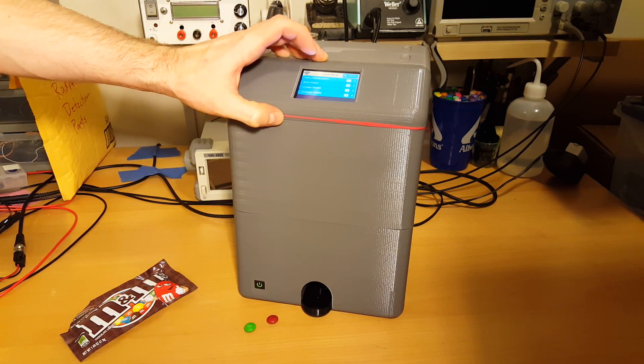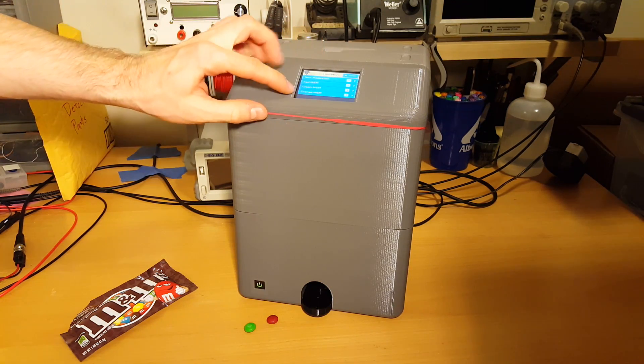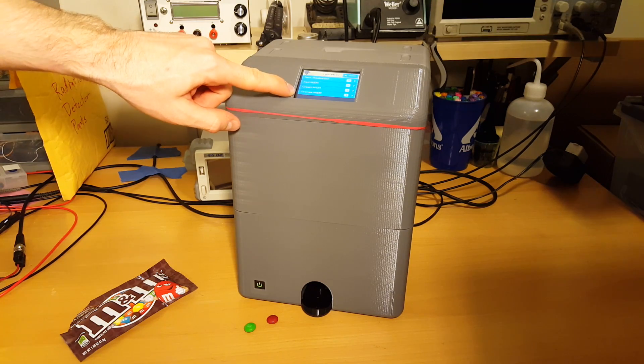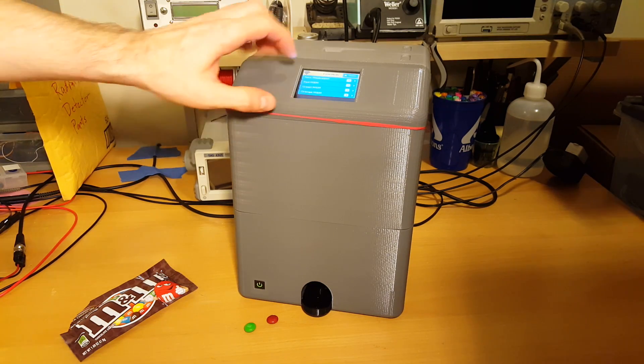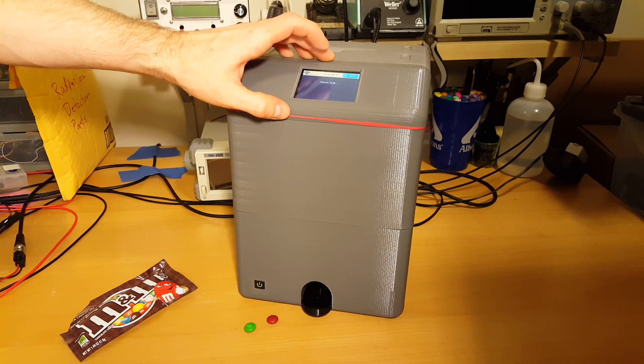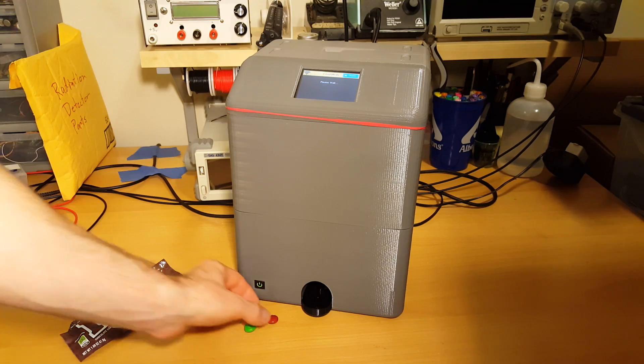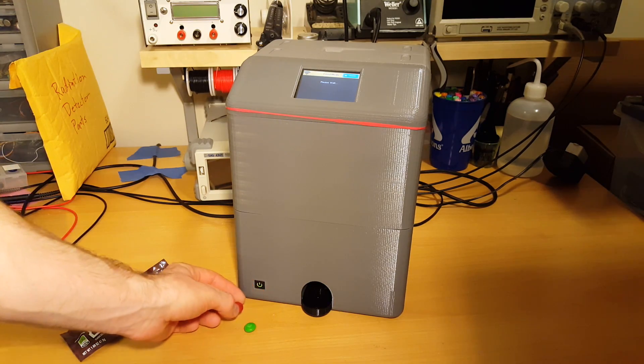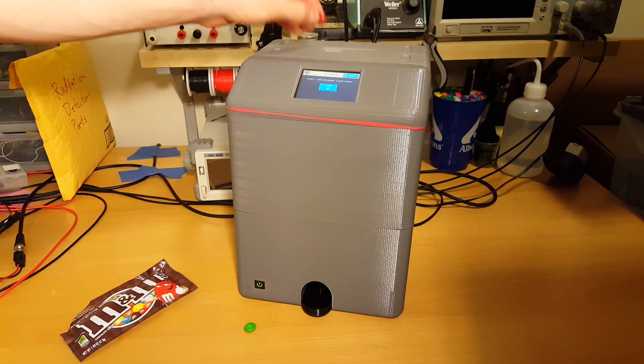I'm gonna hit the load button. Notice there's already a couple M&Ms in the machine. Let's go ahead and load the red M&M here. It's rotating to the correct position to load the M&M.